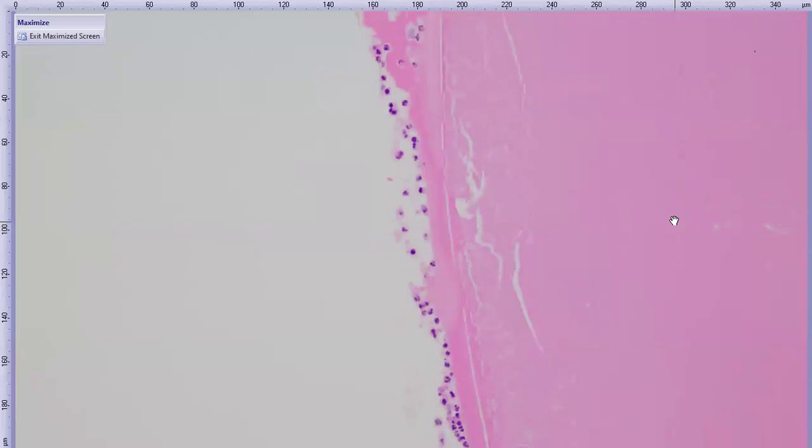However, yeah, it kind of just blends in, and the capsule itself is basically being decompensated, it looks like in this case, and nibbled on. So there are areas where it's a little bit less clear, I would say. Agreed on that. So yeah, that's really cool. And what I think this demonstrates is that to some extent, the inflammatory cells themselves may be releasing matrix metalloproteinases, things like that, that may be breaking down the lens capsule a bit. Or it shows that the lens proteins can leak out through the capsule with phacolytic uveitic processes, which is kind of cool.